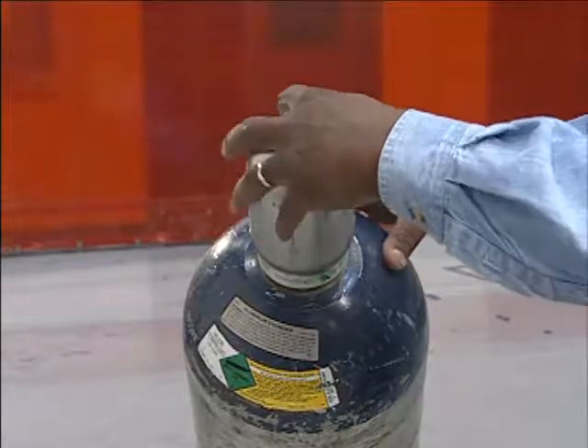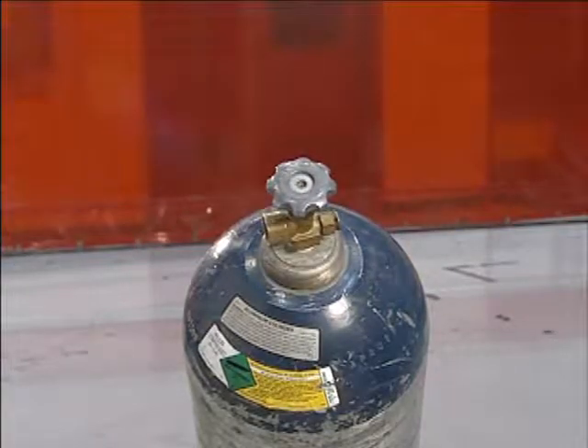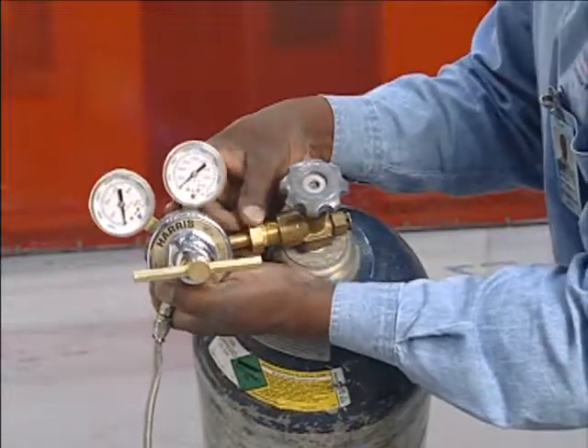To begin this process, start with the helium gas bottle. Install the gas regulator to the helium bottle.